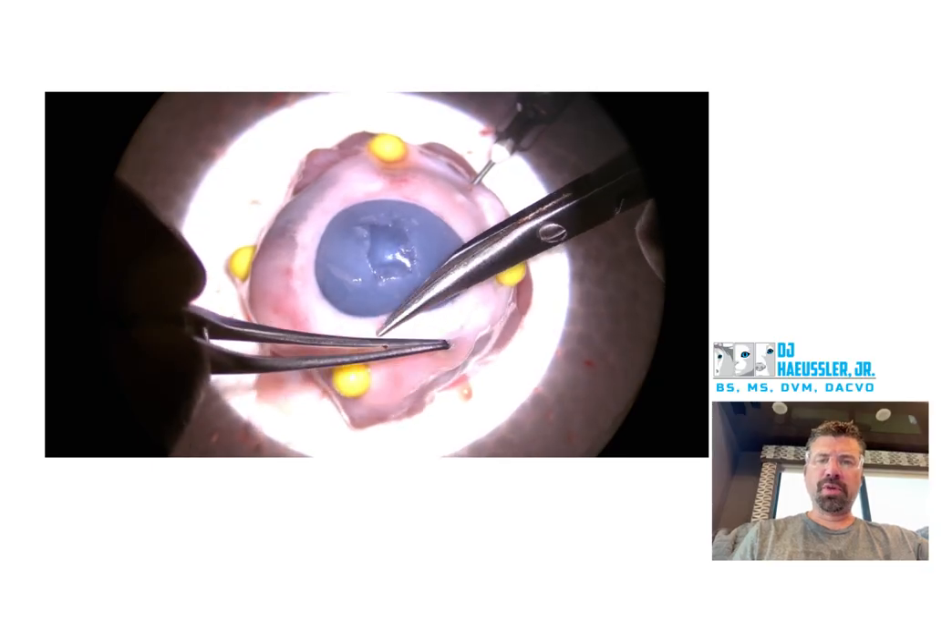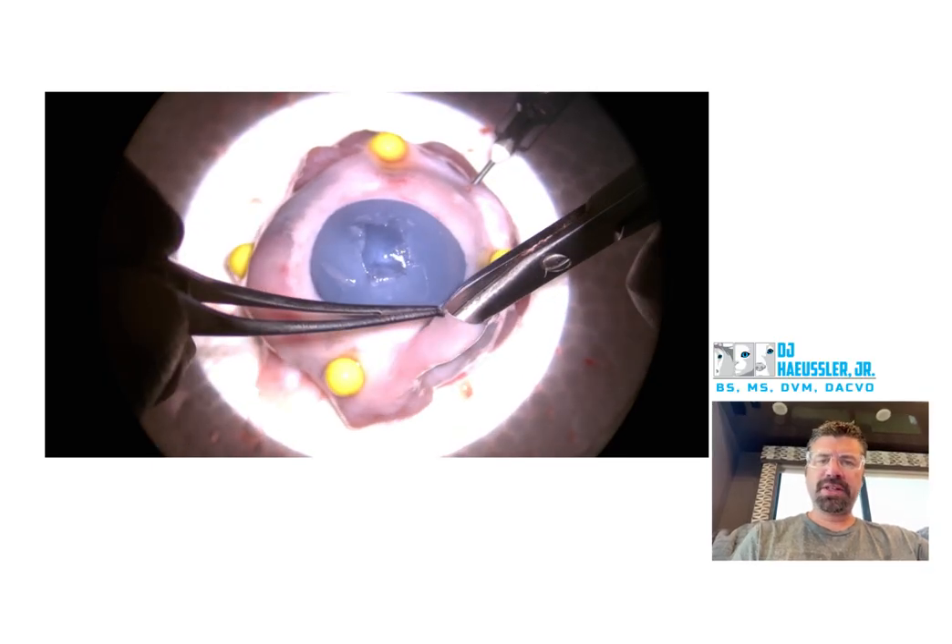You want to be a little bit more dissecting — do your blunt dissection a little bit further this way before making your limbal cuts right there. Try to work on that a little bit further.